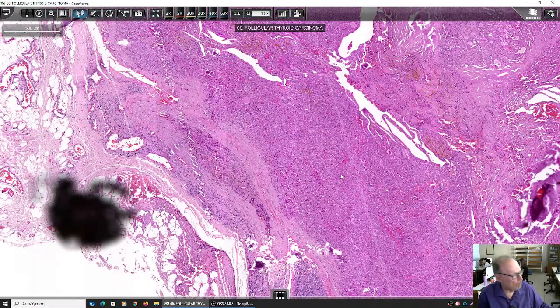Both papillary cell carcinoma and follicular cell carcinoma express thyroglobulin immunohistochemically because they are well differentiated tumors and their cells are immunopositive for thyroglobulin because they are well differentiated cancers of thyroid follicle epithelial origin. However, this one gives hematogenous metastasis. It spreads in another way, so it is of crucial importance to diagnose this low-grade, well-differentiated follicular cancer as follicular carcinoma and not papillary carcinoma.